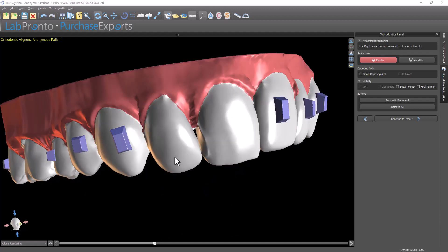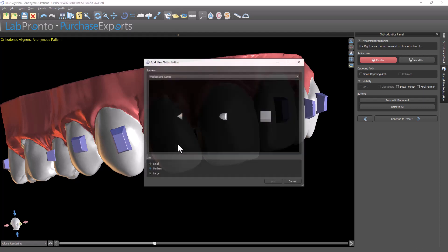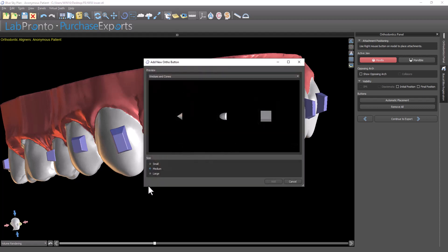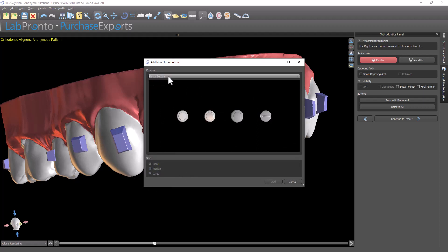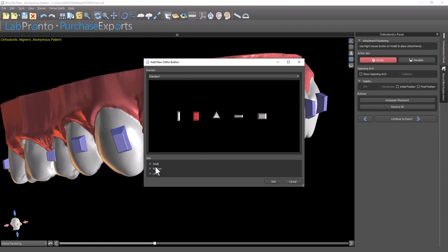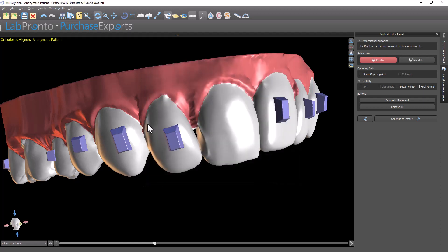Simply right-click on a tooth, choose add button, and you'll access our button library. We have several different options and sizes from the dropdown list. Select the set you'd like to place, select the relevant button and the general size. You'll be able to resize once it's placed. Click add button and the button is added.